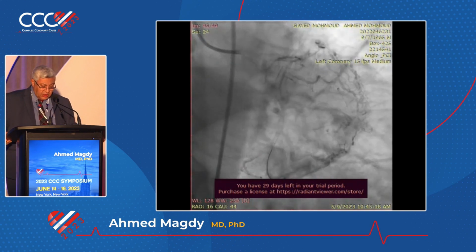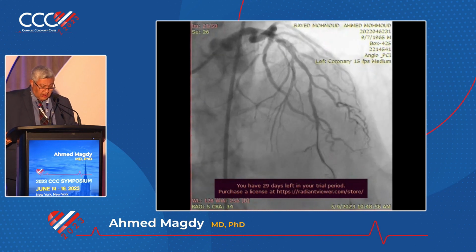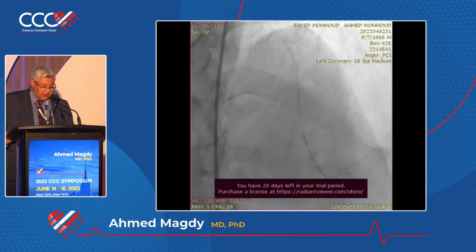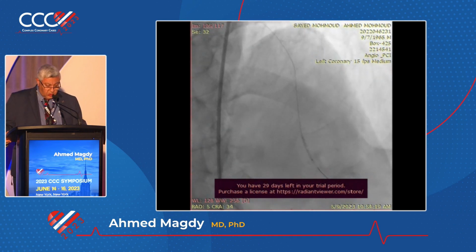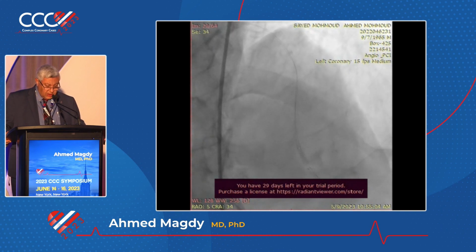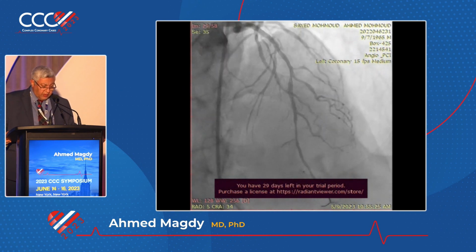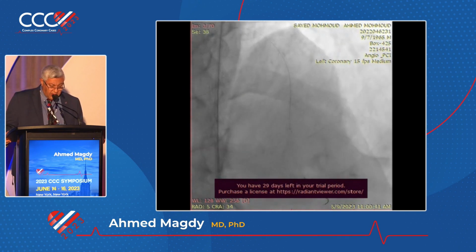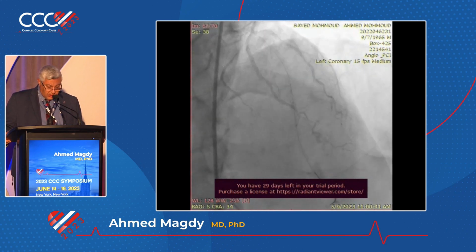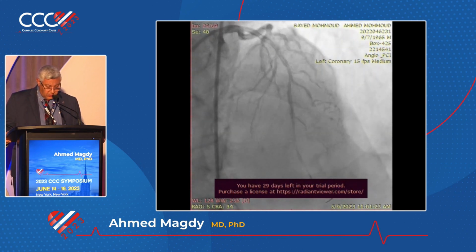These are the kind of patients with diabetes. And remember that if you use a drug balloon, you prepare the region very well and then end with the drug balloon. And so we just dilated the distal LAD. You must be careful in wiring and don't overinflate. And then finally, we put a long, 30 millimeter DCB, and it went well.